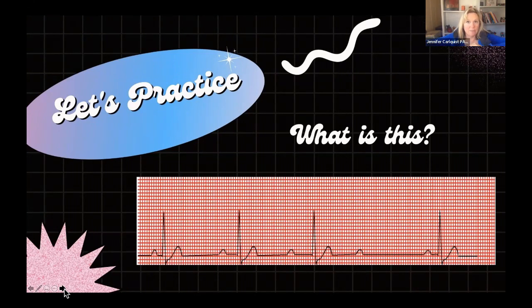First time I saw that, I was like, what? This guy needs a pacemaker stat. And my cardiologist quickly replied, actually, this could be a normal variant, that in first degree block. It's funny because as a paramedic, anytime somebody was in this rhythm, they usually progressed on to something worse, right? My N of whatever was all skewed to everybody dies when they have this. And he was like, no, actually, not everybody dies.